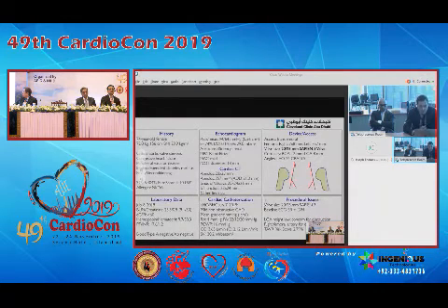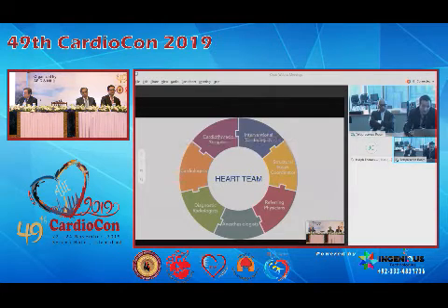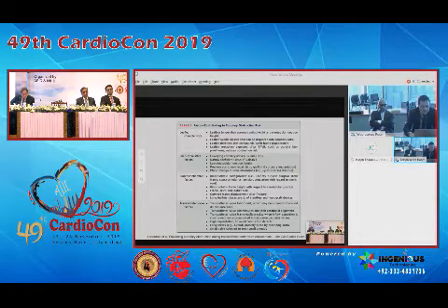So let's go back to the case that Dr. Lubna mentioned. Again, we put a lot of thought into her case. She qualified for a 23 millimeter valve, but she was clearly at high risk for coronary obstruction. But as the counterpart of that, she was intermediate risk by STS, but high risk by frailty. And so our heart team met and decided that the best option for her was a measured, controlled, high-risk TAVR. And so the characteristics for her, again, that make it difficult are that she has very low-lying coronary ostia and a narrow, deficient sinus of Valsalva.